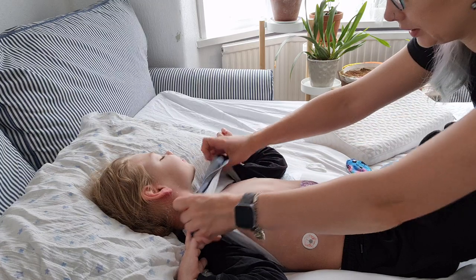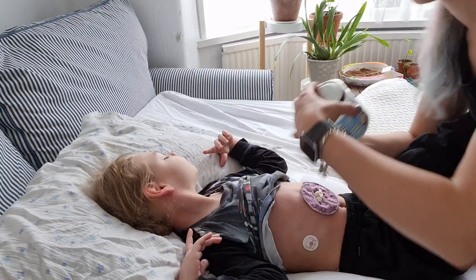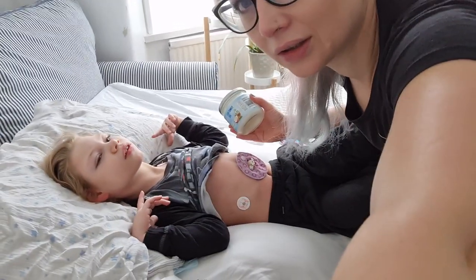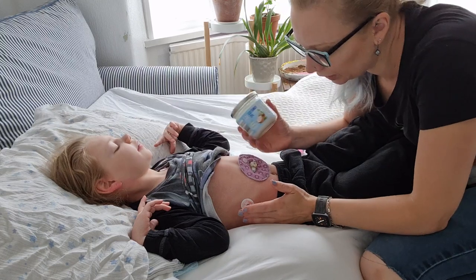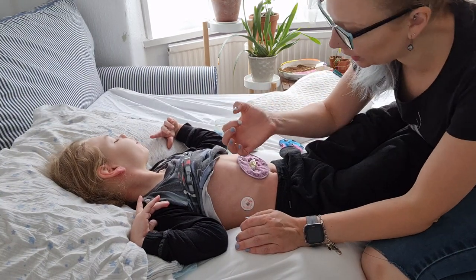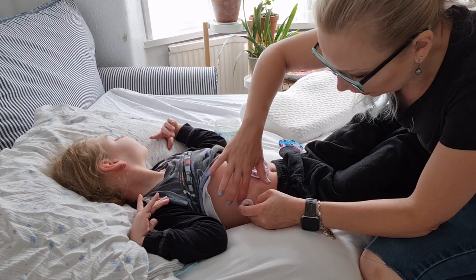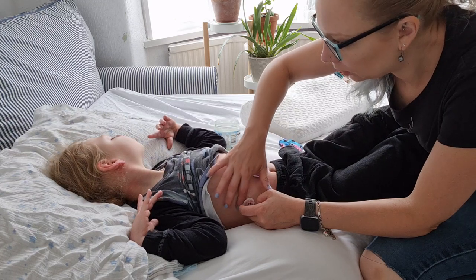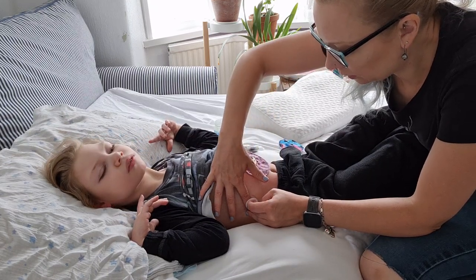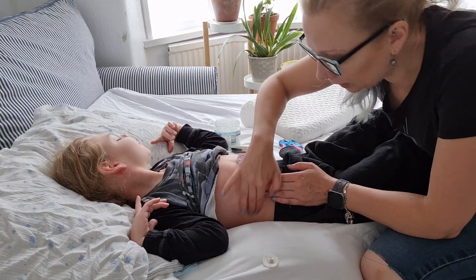So she has a sticky here. There's stickies here and here that I need to get off. And here's my trick. Coconut oil. Sorry, I know you can't see me. Can I move this a little? I want you to see what I do as well. Coconut oil removes the sticky pads and the sticky residue from them really quickly and easily. So I've got some coconut oil on my fingernail. I'm going to put it around the edge here, get it underneath the edge, and then I just work it under. And the sticky comes off. And then I rub in the coconut oil, and it's going to sit there and work for a little bit.